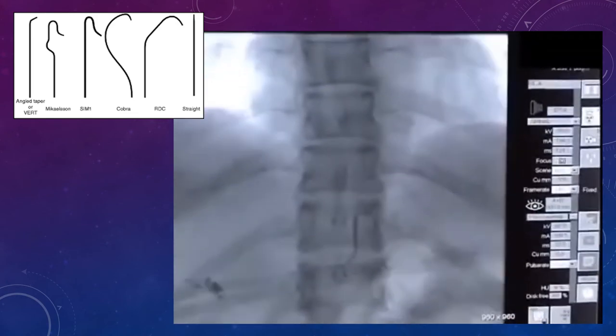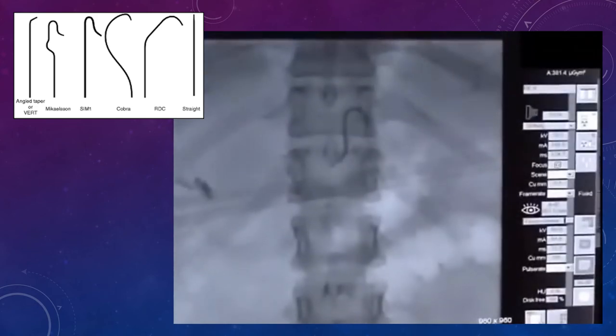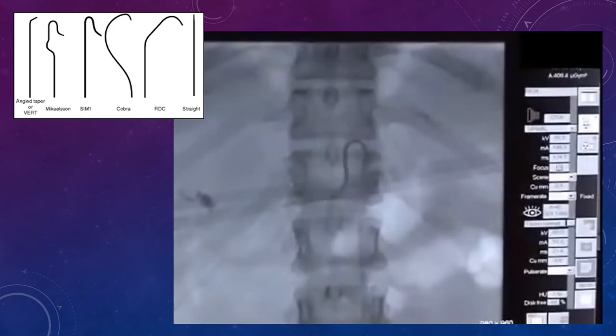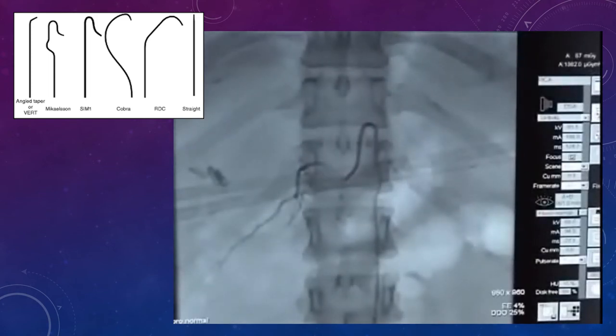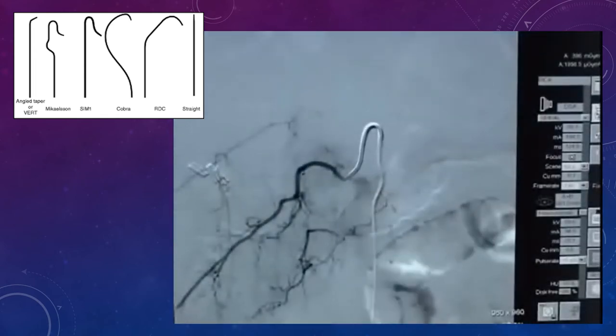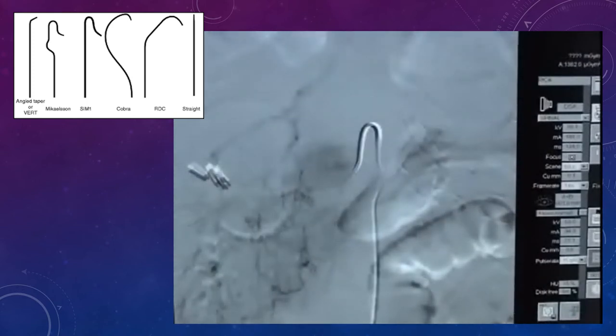We can see the catheter entering different spinal radicular arteries, but the doctor wants to start at a particular level. A total of 25 to 30 individual vessels will be studied here. And we can see now a dye being inserted into a spinal radicular artery. Now a formal run will be done to document the image, and this will be saved for later review.